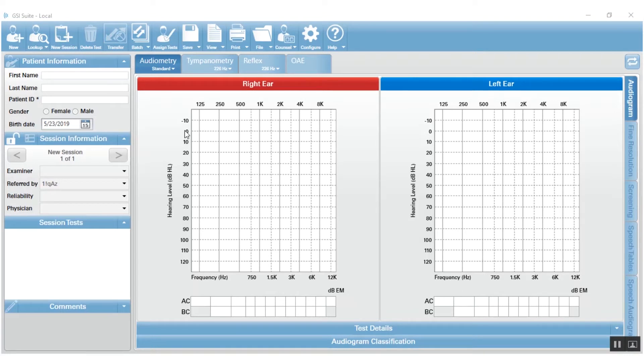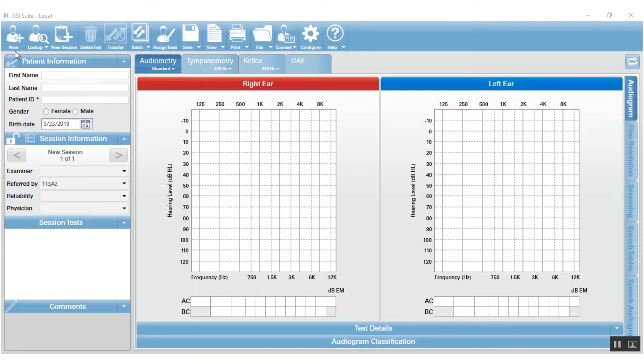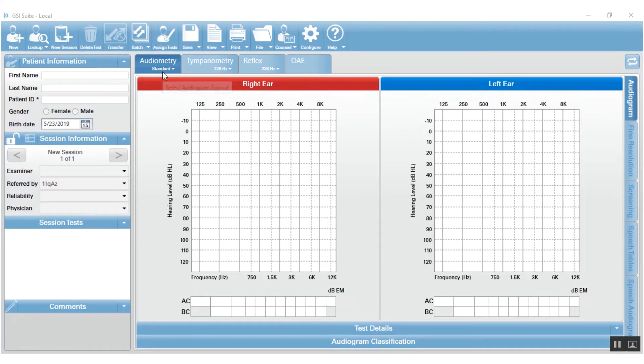GSI Suite is essentially divided into three main or basic sections. The first section is this top menu line here and you can see all the different icons have to do with functions of overall suite. So the new and lookup in session are the database functions, the transfer and batch and assign tests. Those are very specific to different test types that we are using with our equipment.